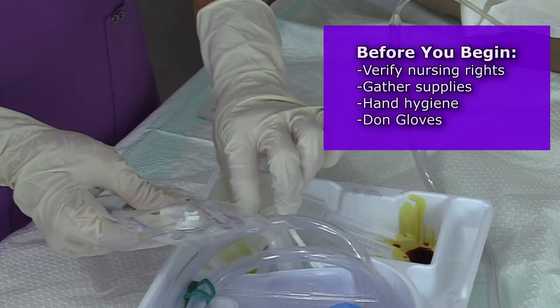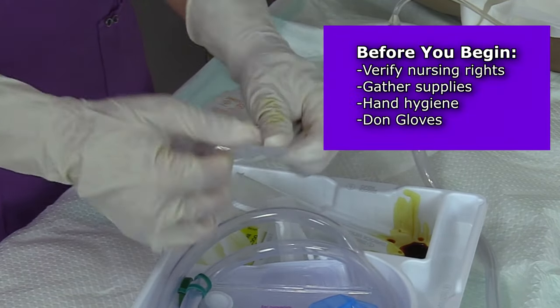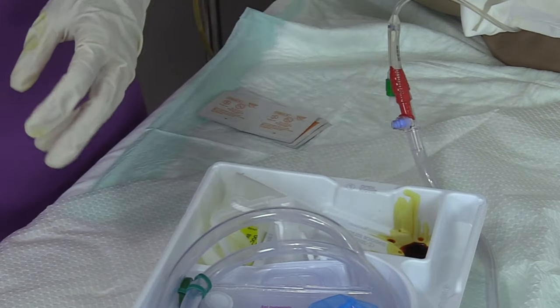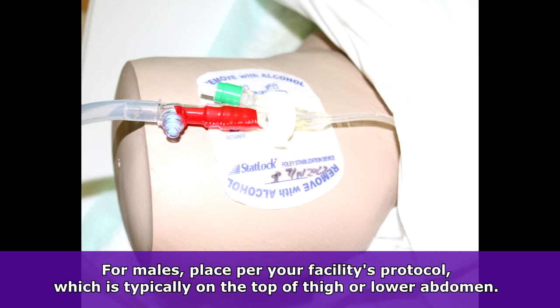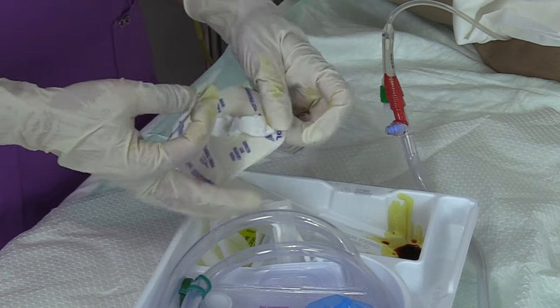We're going to get our STATLOK device and open up the packaging. Here's the actual device itself. This is going to go on the inner thigh of the female. For male patients, the securement device is usually placed either on the top part of the thigh or the lower abdomen with the male's genitals positioned toward the abdomen. However, you always want to follow your facility's protocol for securement device placement. There's also a skin protectant pad which is going to be applied prior to putting it on.